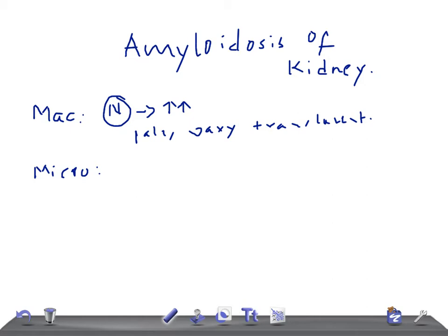Microscopically, the amyloid is seen as amorphous eosinophilic hyaline extracellular material. In the kidney, it is deposited in the glomeruli. Initially it gets deposited in the glomerular basement membrane, but later extends into the lumina, causing luminal narrowing.